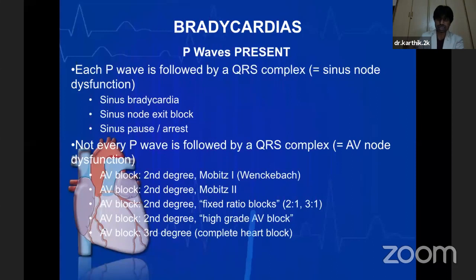When you see such kind of ECG patterns, you should know that the patients are at imminent risk of developing complete heart block, where the impulses which originate at the level of the sinoatrial node will never traverse across the AV junction and reach the ventricles. So they get completely blocked at the level of the AV junction. They fail to reach down to the ventricles. So when this happens, there is no stimulus, and the ventricles will start failing to pump.